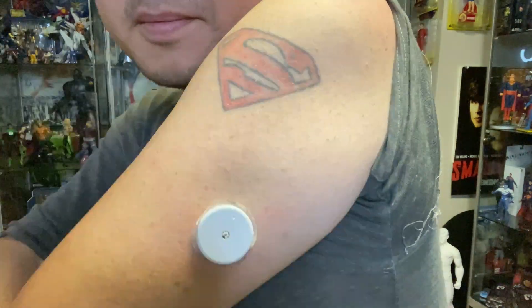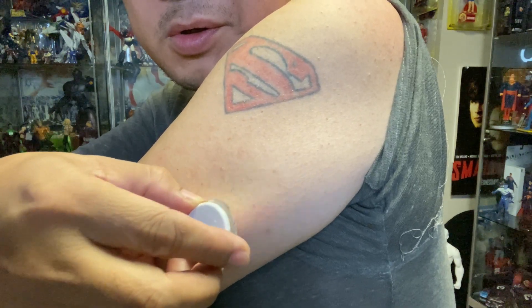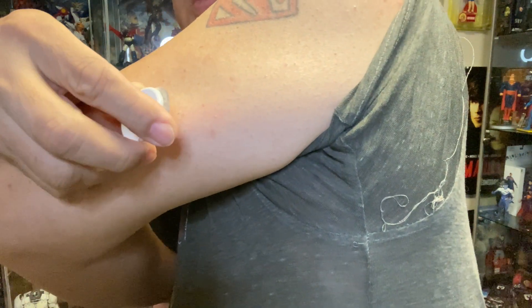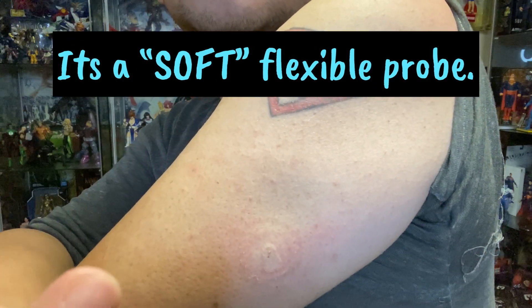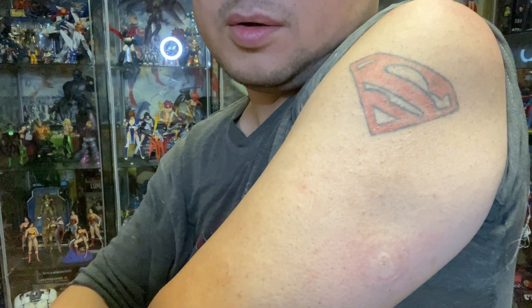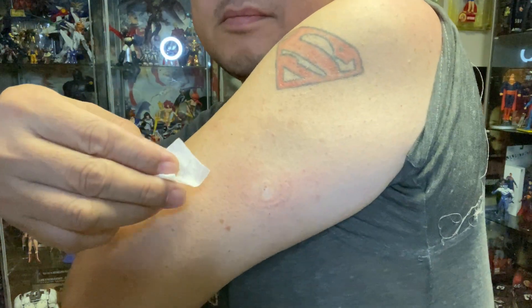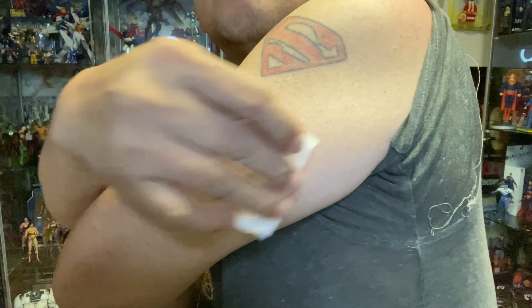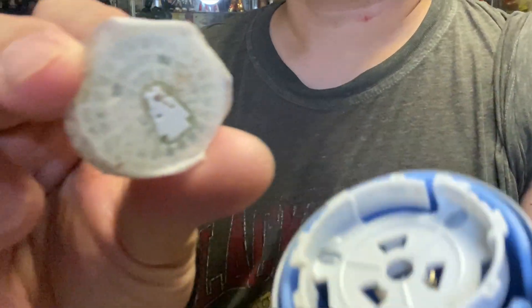Do not detach the probe and leave it embedded in the skin. Then gently pull the sensor away from the skin. Dispose of the probe part in the original plastic casing.